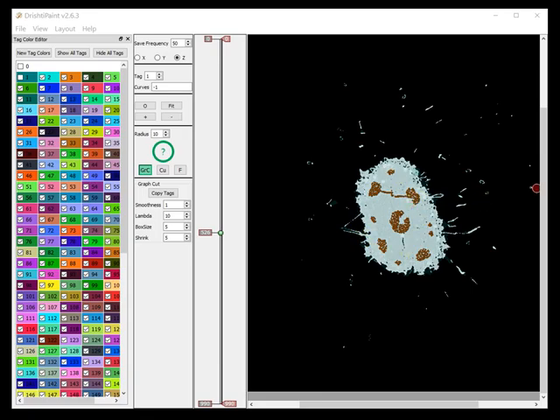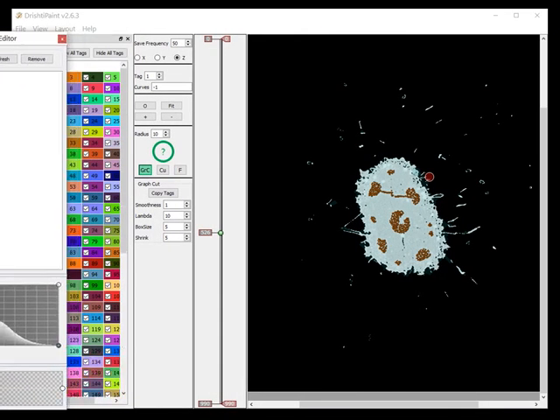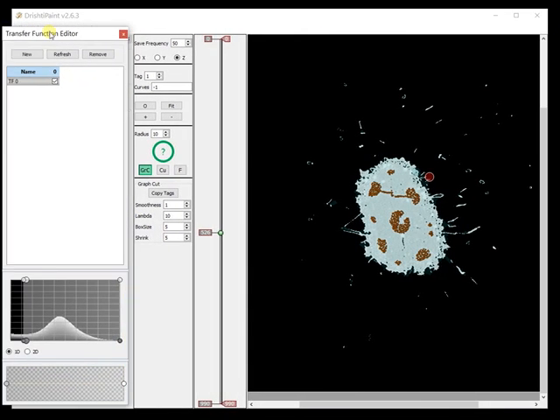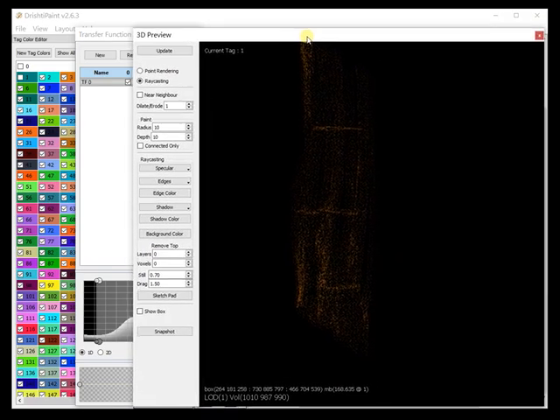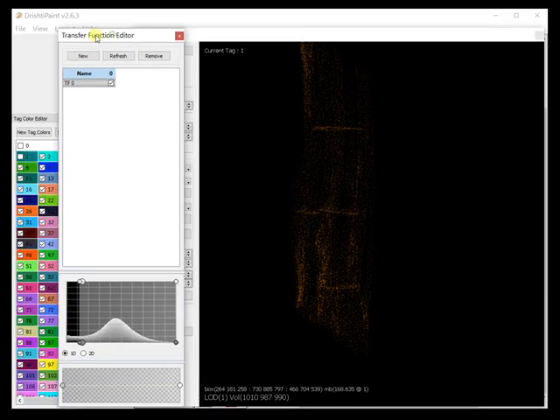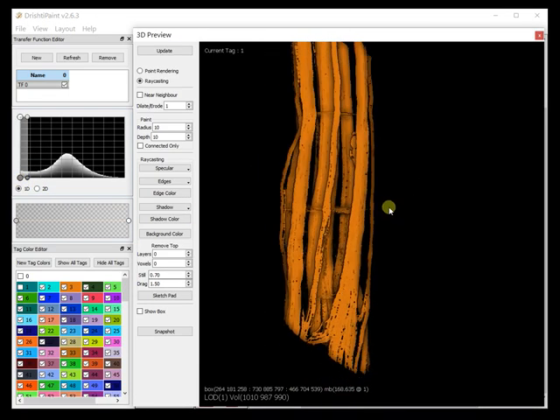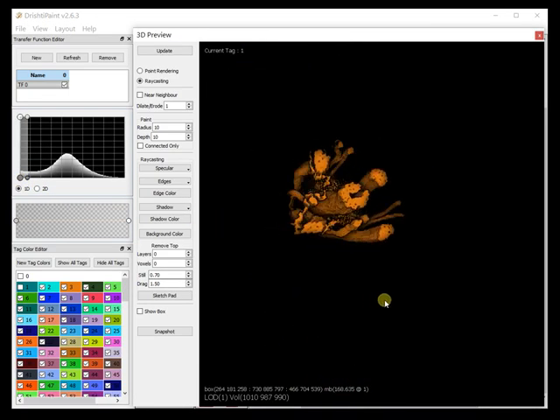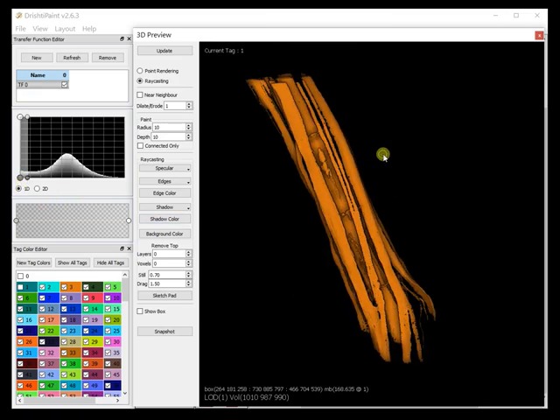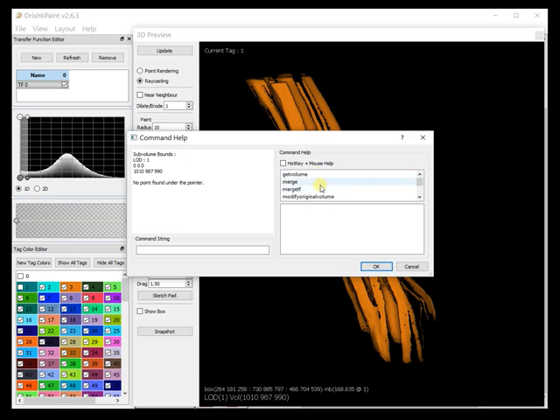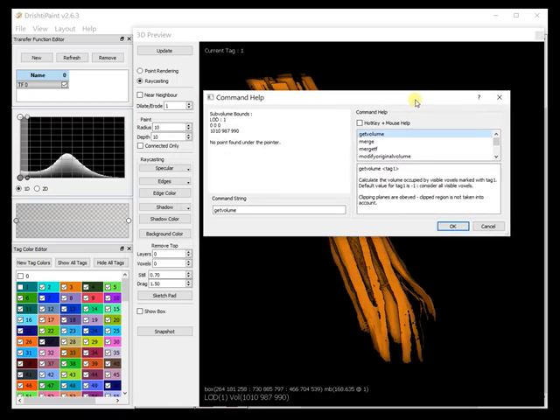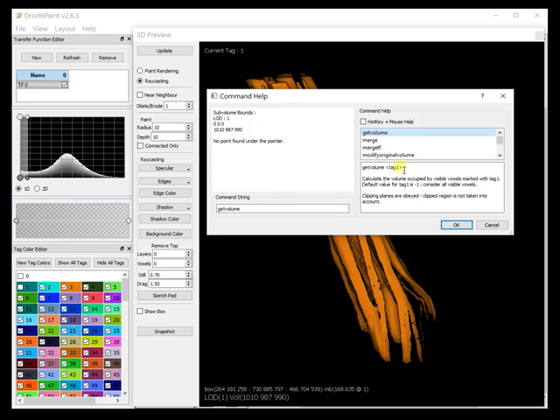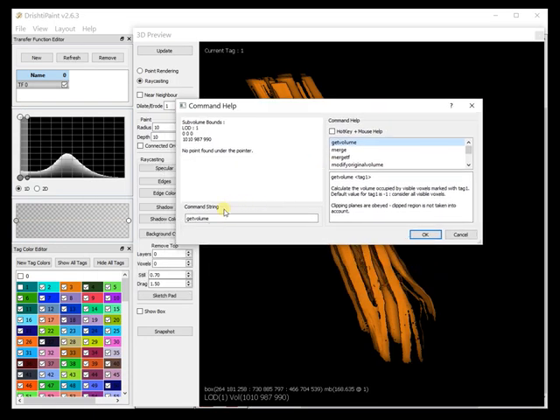This is what we have and now if we want to get the volume of the interior vessels, let me change this tag here. These are the vessels and now in order to get the volume just press space bar and then there is get volume tag. If we don't specify any tag then anything that is visible will be considered for getting the volume. Since we are only showing the vessels that we are interested in we can just give get volume.